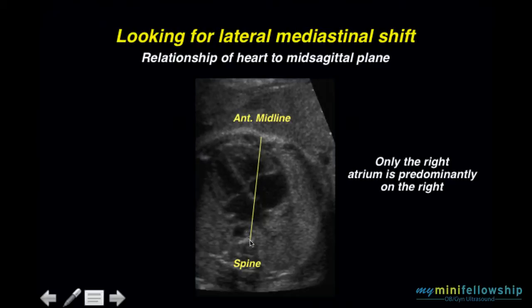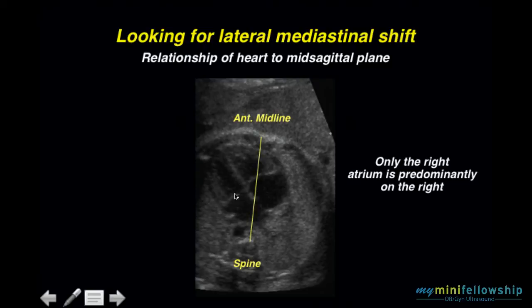We mostly concentrate on lateral mediastinal shifts. In this circumstance, I mentally draw the mid-sagittal plane to look at the position of the heart. The canting of the heart into the left hemithorax causes some problems, because only the right atrium is predominantly in the right hemithorax. The entirety of the left ventricle, nearly all of the left atrium, and nearly all of the right ventricle are in the left hemithorax.